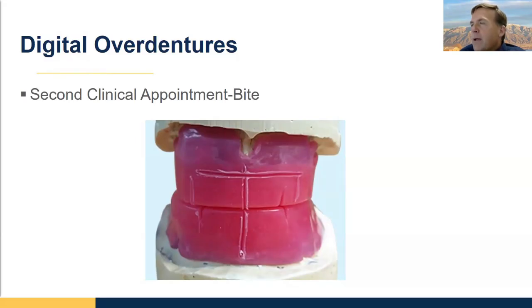So, let me back up the truck for a minute. Remove the healing abutments, put the locators in the spots indicated by your laboratory, torque them to place, and then try in the base plate. The base plate should seat fully and snap. If it doesn't, remove the attachments, make sure it snaps, and then pick them up. Otherwise, you'll want to go ahead and do your normal bite block procedure. It's probably easiest to do this step with an analog and send the bite block back to your actual laboratory. So in other words, take a physical bite. You can do a 360 scan if you want.